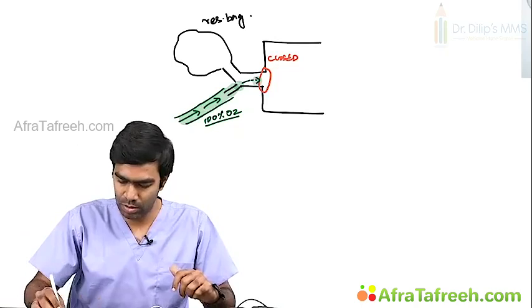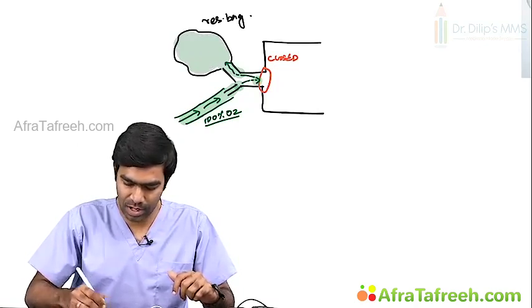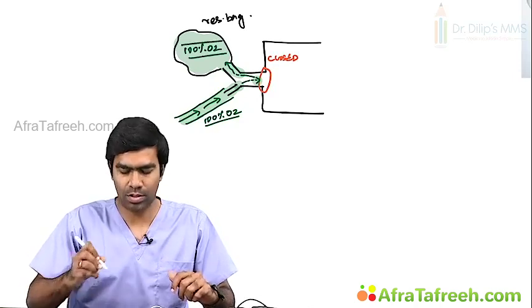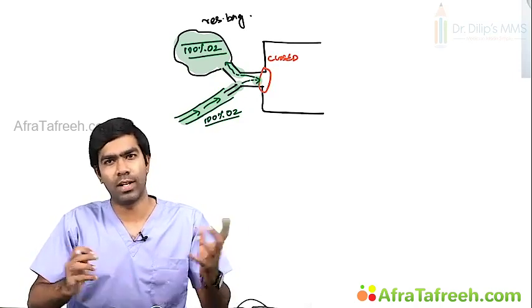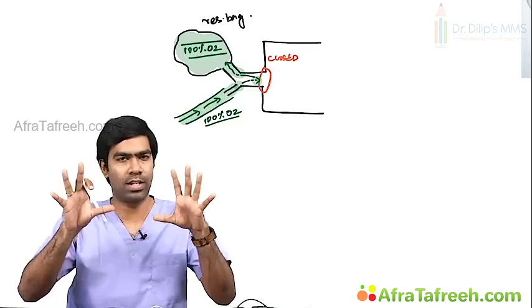Instead, it goes into the reservoir bag and now the reservoir bag gets filled with 100% oxygen. Now the reservoir also will contain 100% oxygen only. Now let us assume you are compressing and now you are reinflating the bag. So now you are releasing the bag.